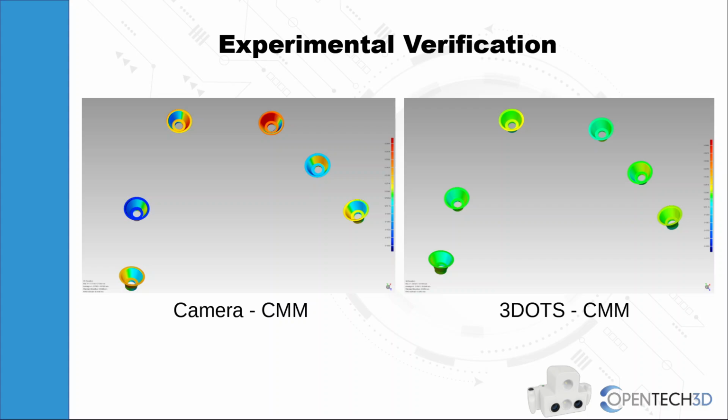Instead, on the photogrammetry side, scanning on the model or scanning in the mouth does not influence the quality of the results. Because with photogrammetry, I don't even see the gum, the tissue, the main cause of inaccuracy of the intraoral camera. The same goes for saliva or blood. With photogrammetry, I don't even see them.